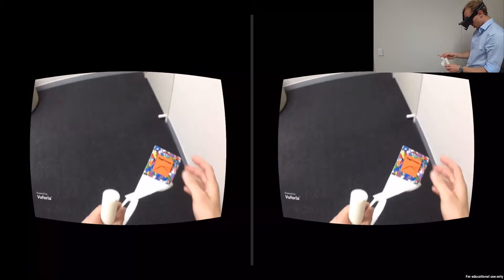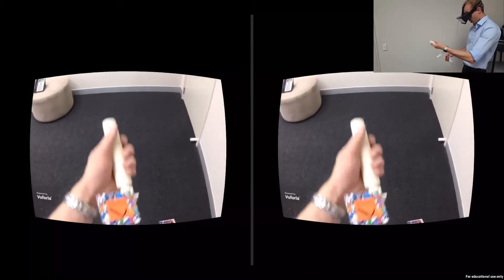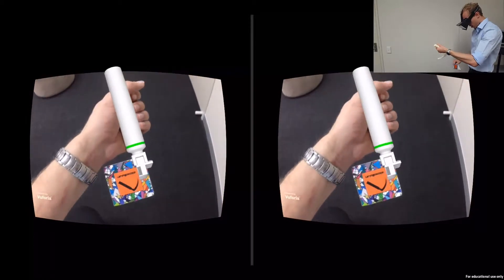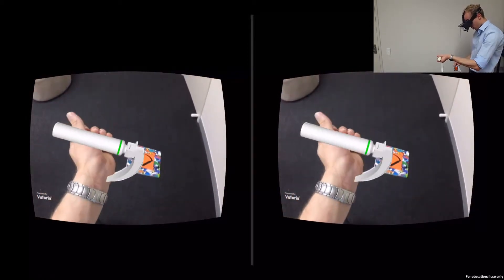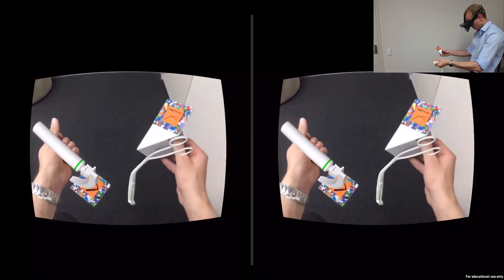This is an augmented reality simulation which uses augmented reality markers to track where particular objects are in the real world using the camera on your head mounted device. Both your laryngoscope and forceps have an AR marker attached to them.